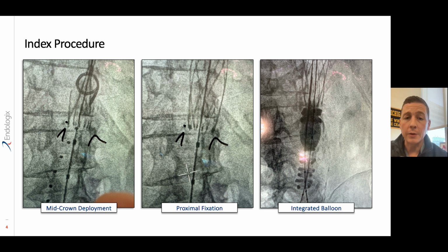land. As you can see, if you look all the way over to our screen right, once we deployed the integrated balloon, there's a reverse taper curve shape that you can see being taken by the balloon, which was what we noted on the preoperative CT scan as well.